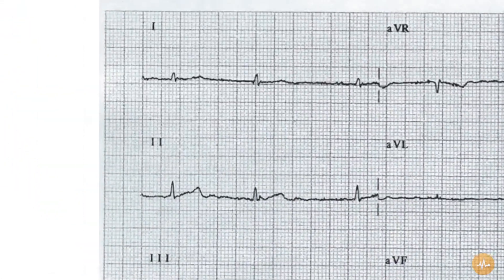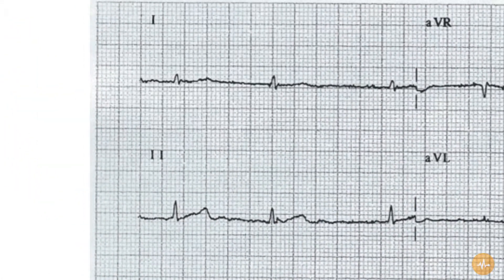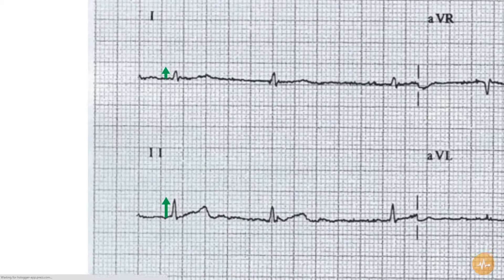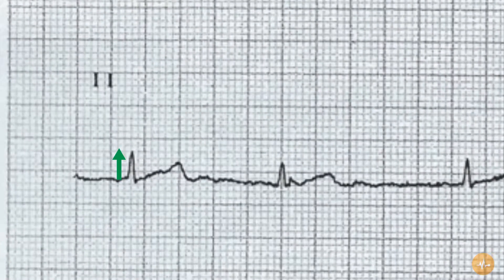The axis is normal with an upwards complex in lead 1 and lead 2. It's impossible to comment on P waves or PR intervals due to their absence, but the QRS duration is normal at less than 3 small squares.